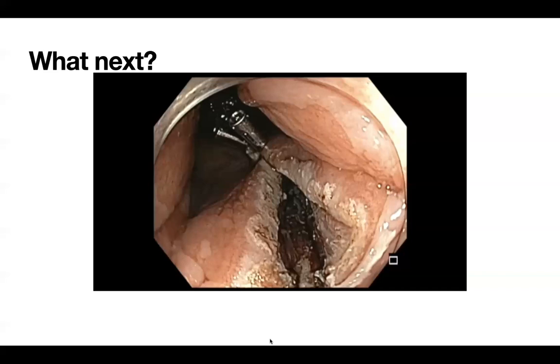It's an amazing phenomenon when you use it. The vessel just evaporates in front of you, and the area becomes nicely coagulated, and you don't seem to need a lot of power as well. And then you get all possible remaining neoplastic tissue off. You get all of the blood vessel off.